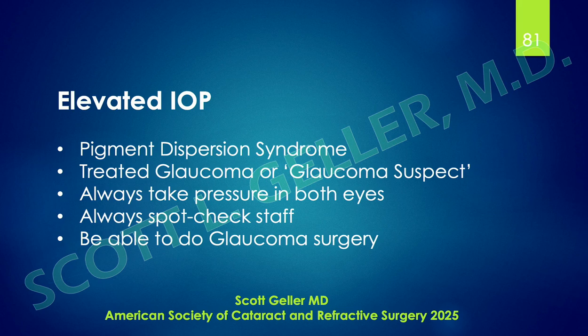I think it was a little more than blurred. The bottom line is he had a pressure spike that was blanching out his vision like any acute elevated pressure spike can do. So when he went in for his next visit, maybe it was a week or maybe it was 3 weeks, the staff used a Tono-Pen.